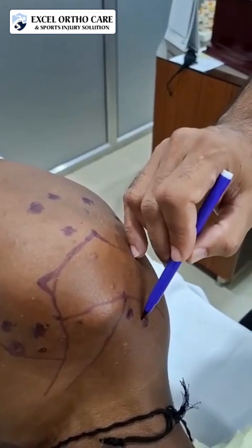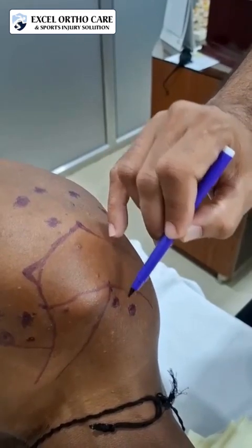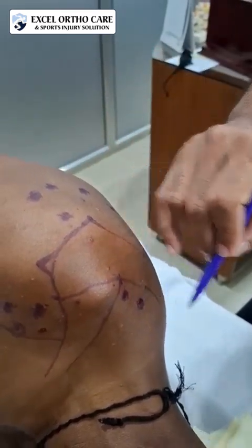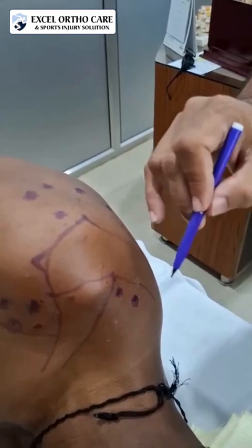Another important portal is the modified Neviaser portal. This portal is just behind the Neviaser portal or 2 to 3 centimeter posteromedial to the AC joint. This modified Neviaser portal is used for the retrograde suture passing in case of rotator cuff repair. So this is all about the portal placement in shoulder arthroscopy.